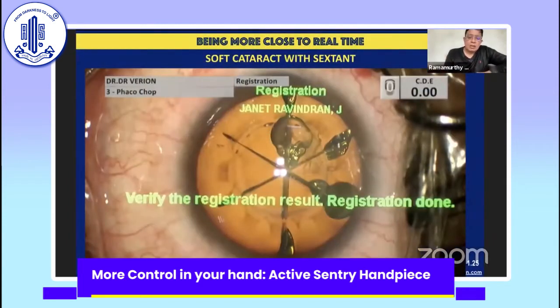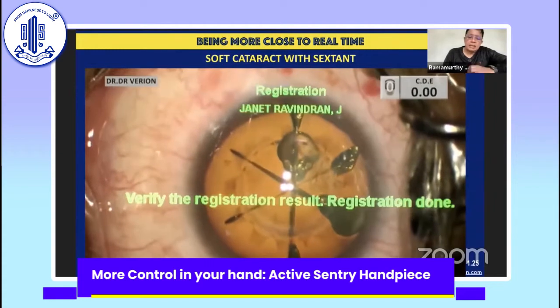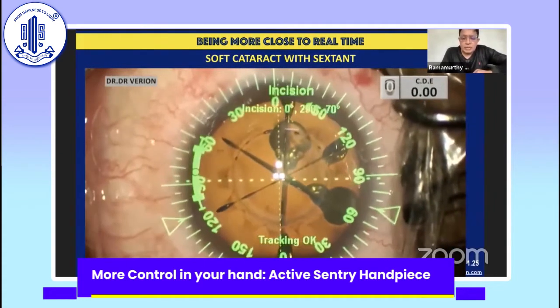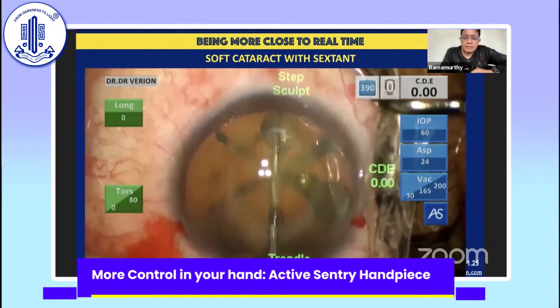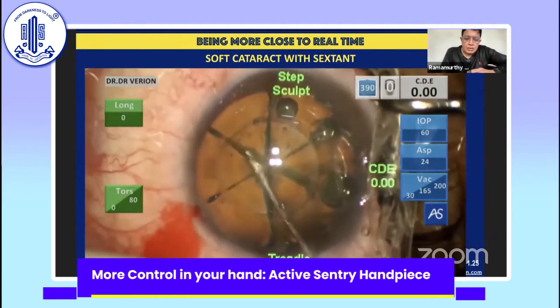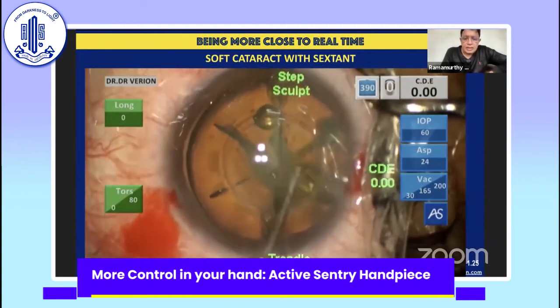Now let's look at some of the videos with the Active Sentry technology incorporated. As you can see over here, there's a fairly soft cataract, and it's already been pre-treated with a laser. What I've done is a sextant. And initially, when I was introduced to the Active Sentry technology, I thought this is going to be extremely useful when treating difficult hard cataracts. But mind you, I've removed the capsule, and the hydrodissection that I do is through the incisions that have been created with the laser.